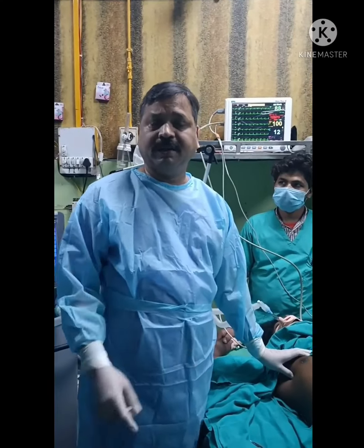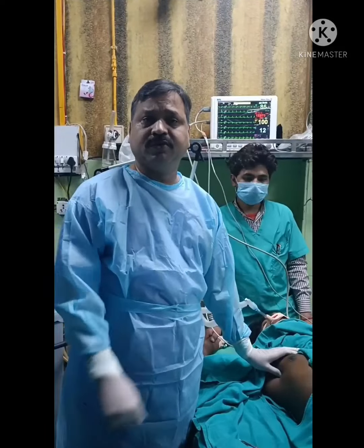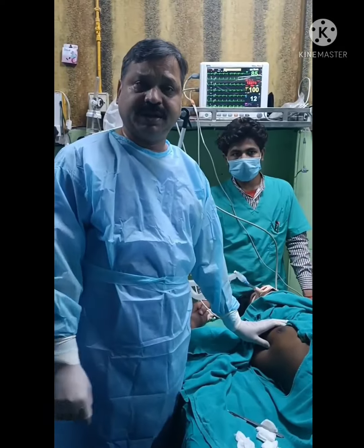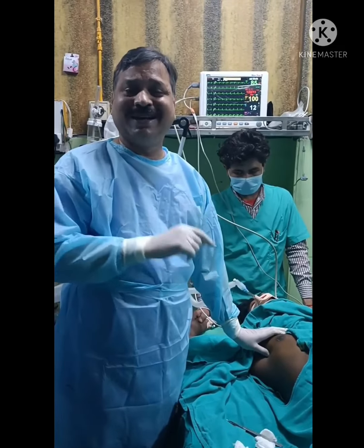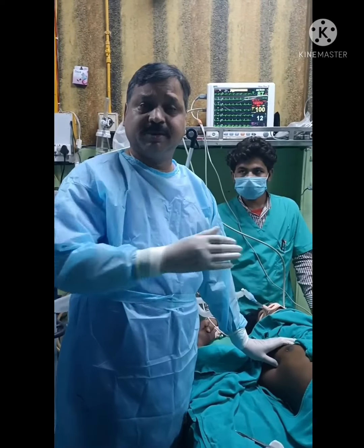Kamarjo, and today I'm going to put a chest tube in a patient of traumatic hemothorax. So we have taped and prepared the patient. I have given the local anesthesia, and now I'm going to give an incision approximately 1 inch long. And let me tell you a little bit of the history of the patient.